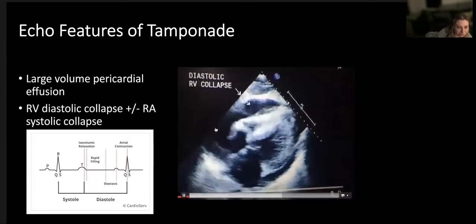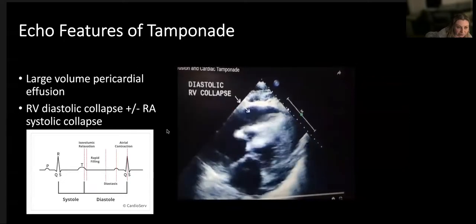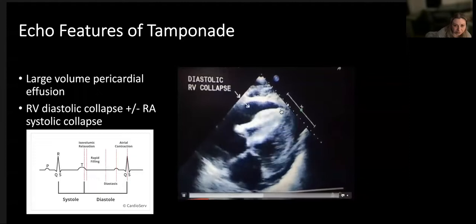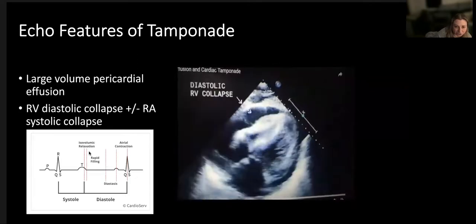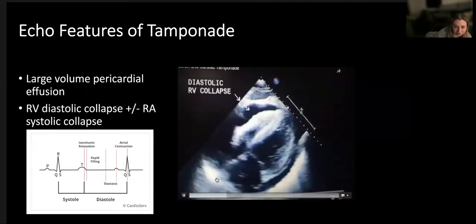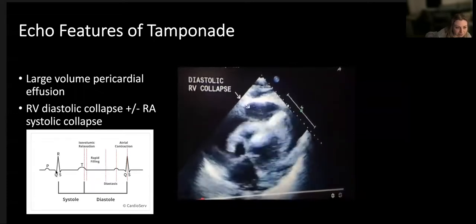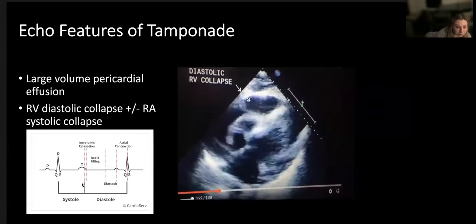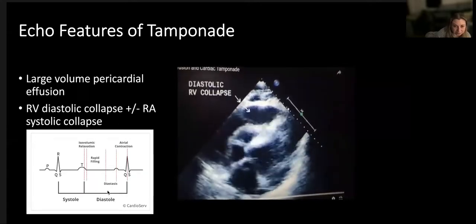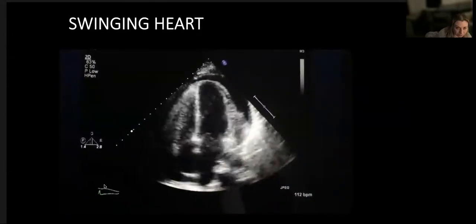At the point where the right heart struggles to fill, we see diastolic collapse or right atrial systolic collapse - it's really end-diastolic collapse. It's important to know the phase of the cycle because it can be difficult to eyeball. I recommend putting on telemetry and the ECG tracing at the bottom of your machine to identify the phase. Right atrial collapse occurs around the beginning of the R wave at the end of diastole/beginning of systole, and RV collapse occurs in early diastole around the end of the T wave.